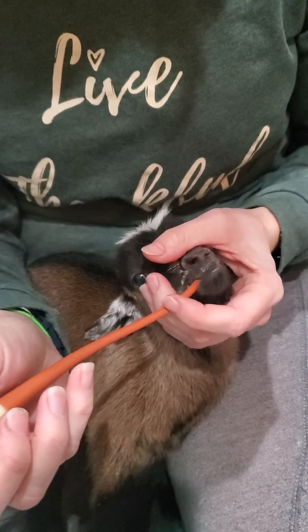There we go. Let me just gently remove it. Hey pretty girl. She'll be good and happy, and hopefully by the next feeding she'll want to suck. She's not weak, she's just stubborn.